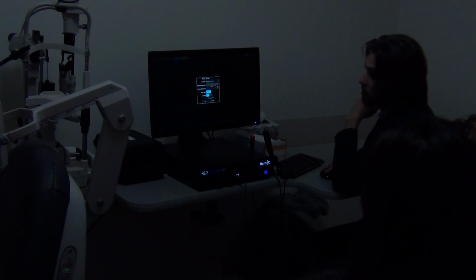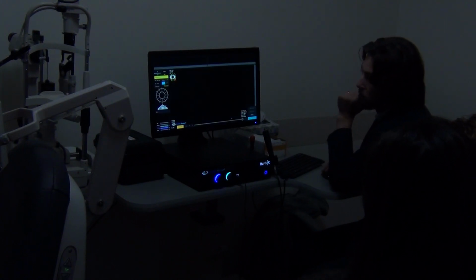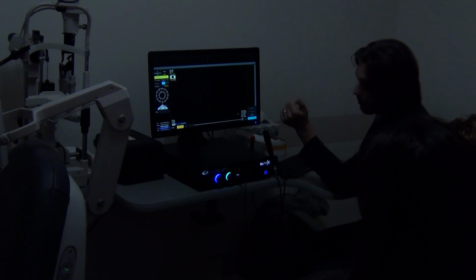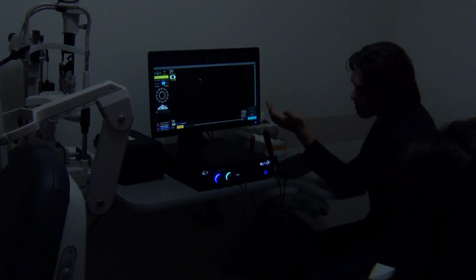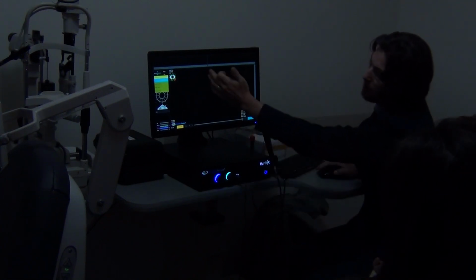you can choose attending physician or referring physician, let's say, if you need to add this information, and click OK. You will be in the viewing screen by now, right? So here you can do your scans with the UBM. Depends on the scan type, you can choose different setting here in yellow, right?